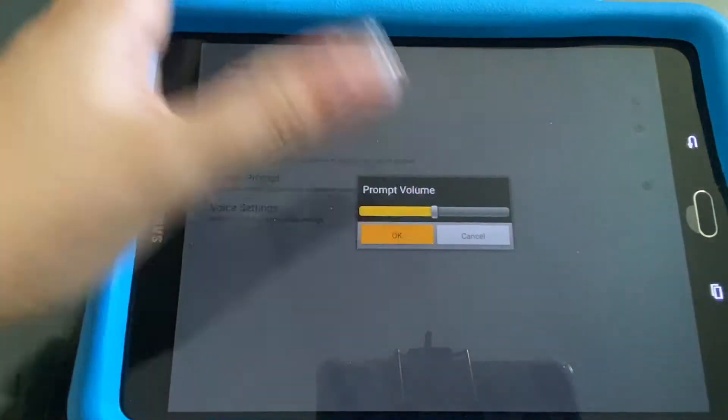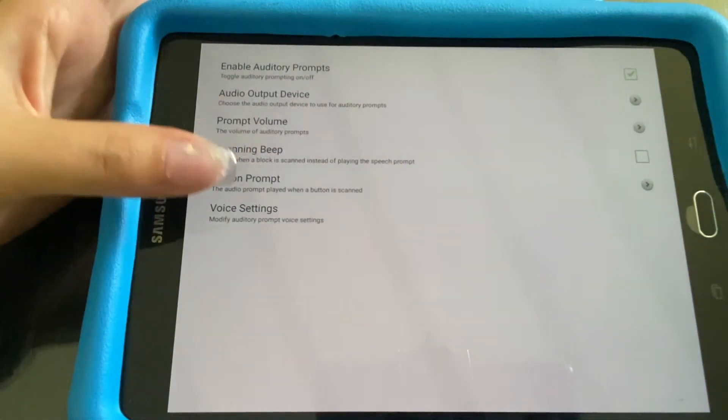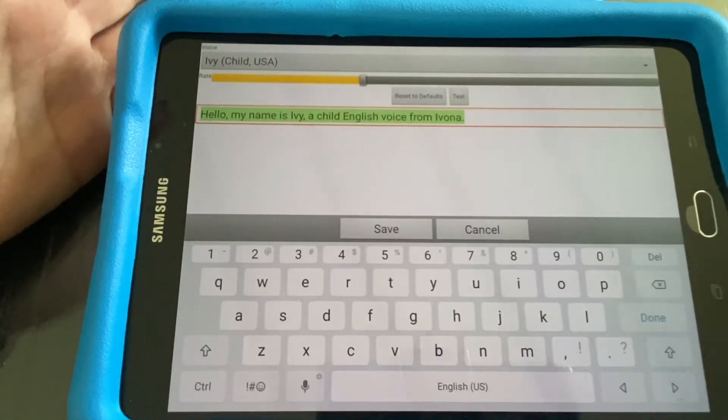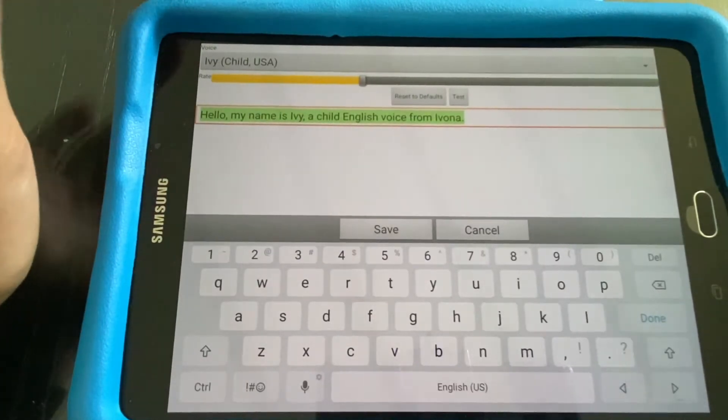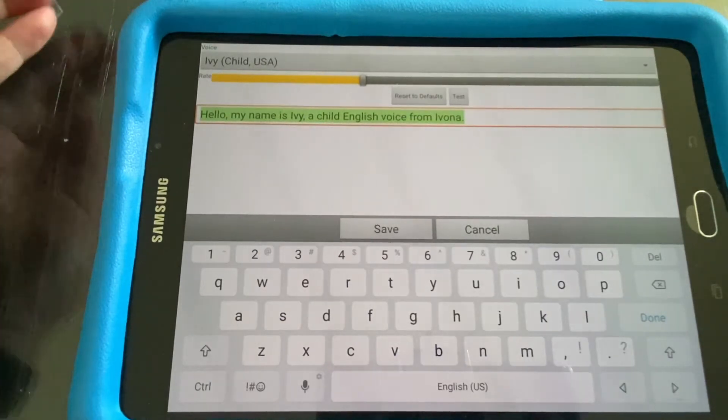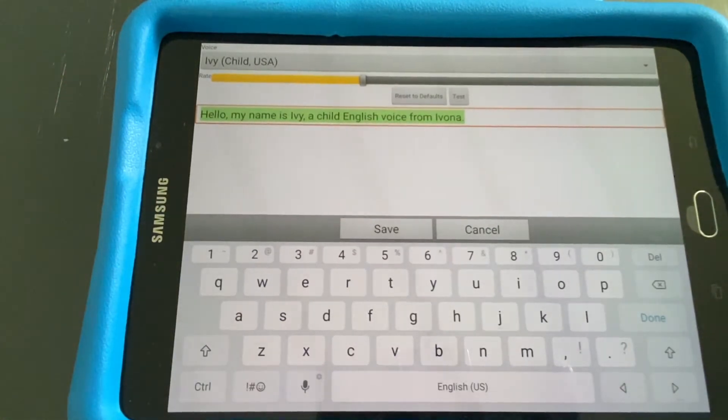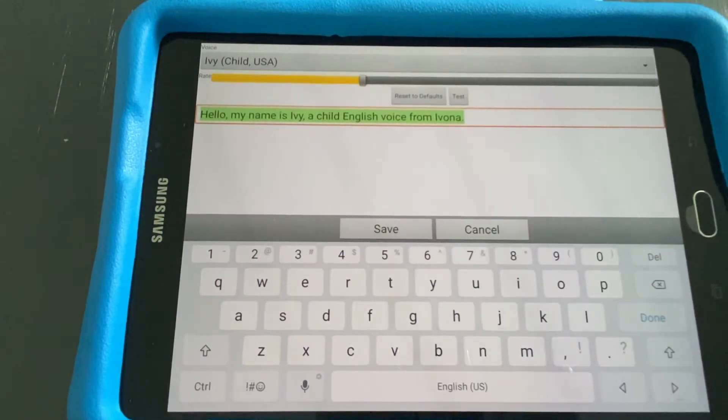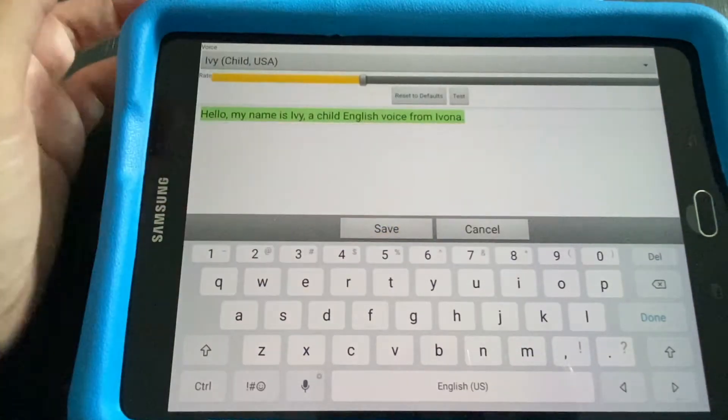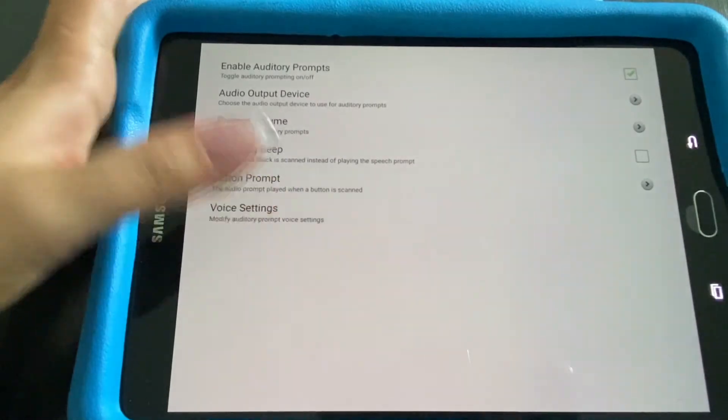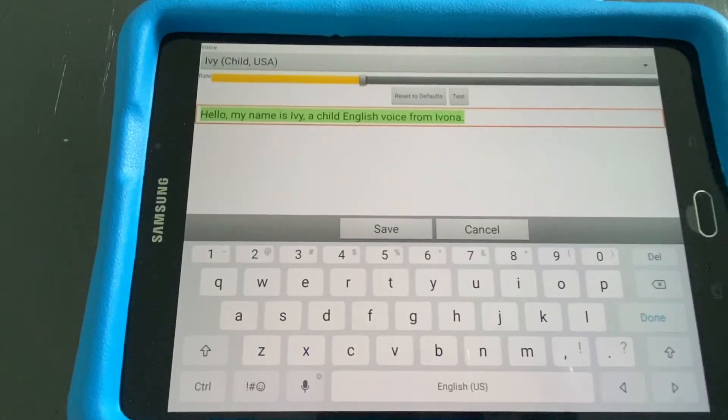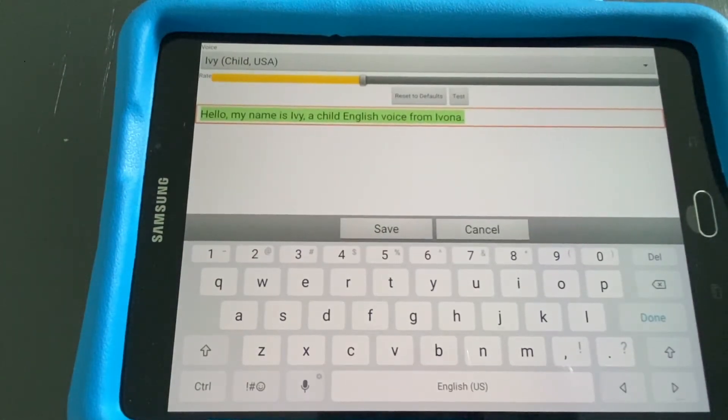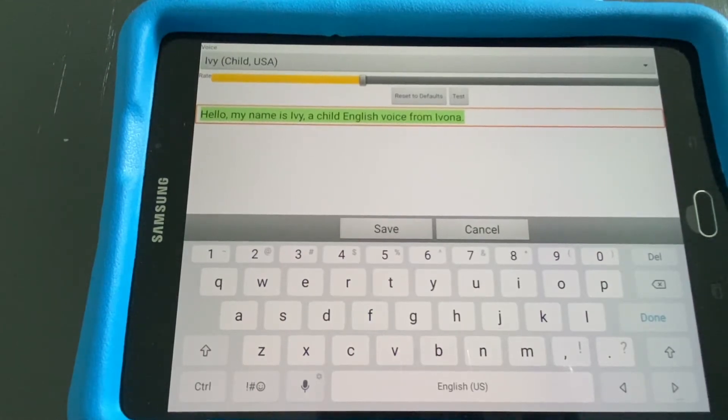Here is the prompt volume, the beeps, and then the voice settings. It's important to keep in mind that the auditory prompting should be of the opposite sex and different age group from the actual voice or the age of the individual that's going to be using it. In this case we have a male adult voice, so the auditory prompt voice is a child.